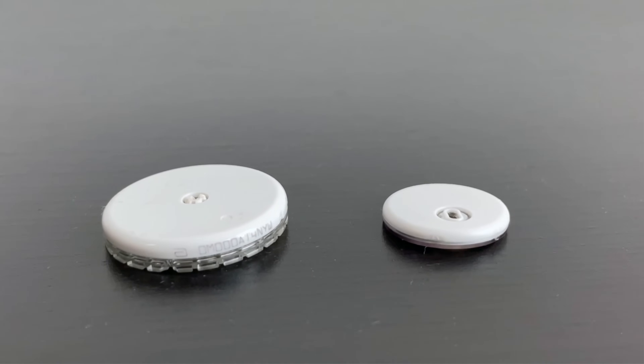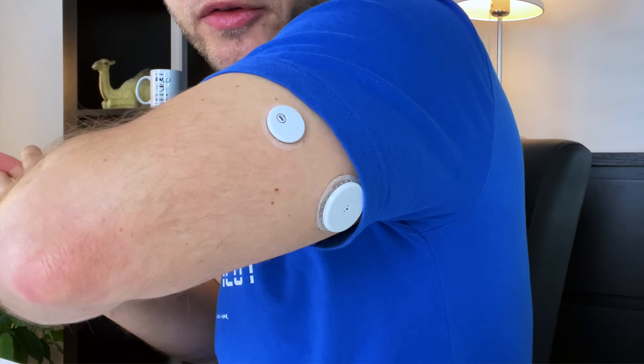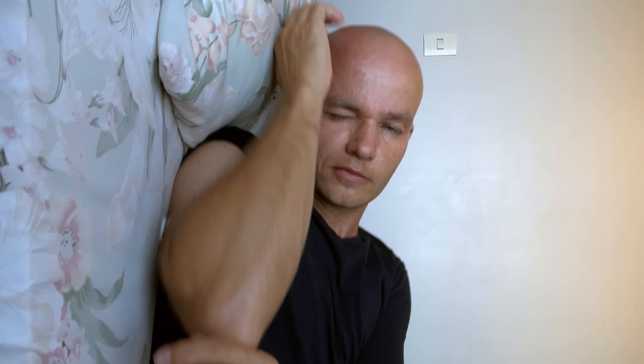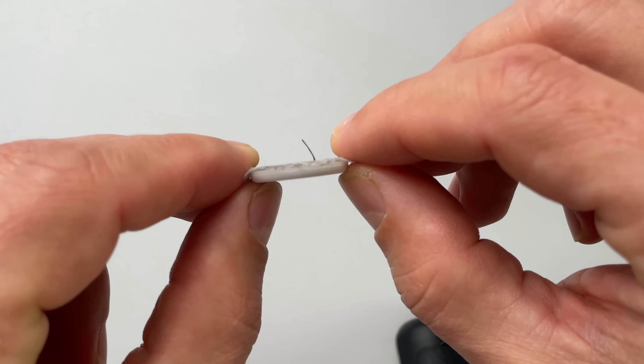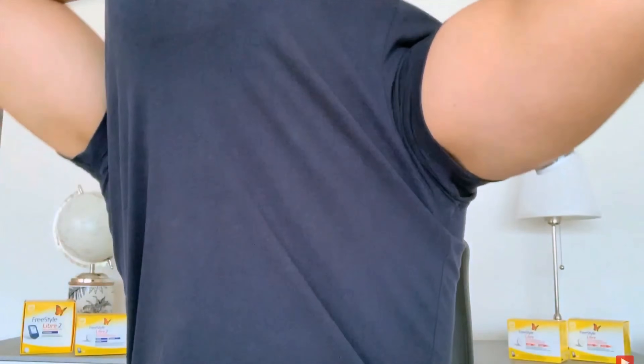Difference number 12 is how well these sensors stay on. Everyone who's ever used a CGM has probably ripped one out on a door frame or when taking off a t-shirt. These kinds of accidents happen to me a lot less with Libre 3, because it has such a low profile. Every millimeter matters when it comes to sensor height, because that millimeter can save the sensor from the strap of your bra or sleeve of your shirt. Libre 3 also feels a lot more comfortable when wearing a tighter t-shirt or when lying on it in sleep. On the other hand, the Libre 3 has a much smaller adhesive contact area, so it can peel off a lot easier than Libre 2, especially when you get caught on something.